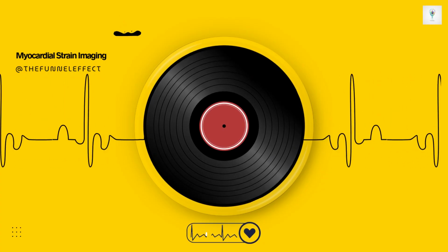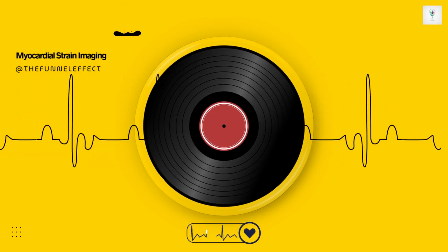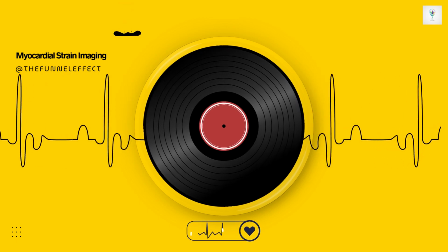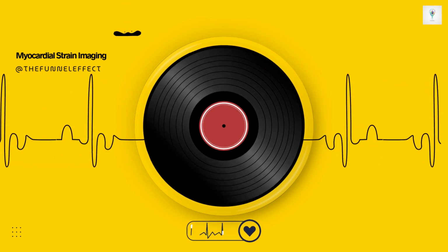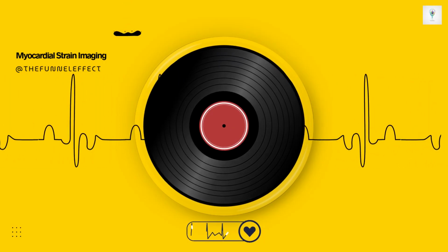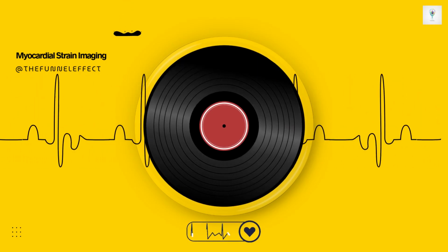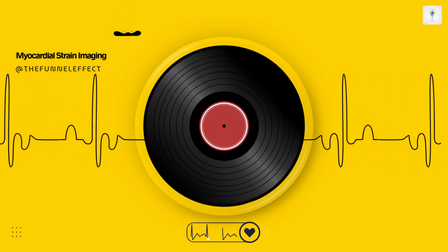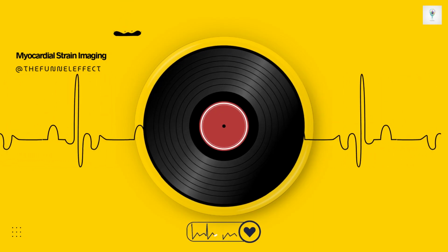Pitfall number 2, selecting the region of interest, or ROI. This sounds tricky, especially in those thick-walled hearts we just discussed. The ROI is the area the software actually tracks to calculate strain. You have to tell it which pixels belong to the heart muscle. Now, if you're imaging a hypertrophied thick-walled heart and you draw that ROI too thinly, maybe only tracing the inner endocardial border, you can significantly overestimate the absolute GLS.